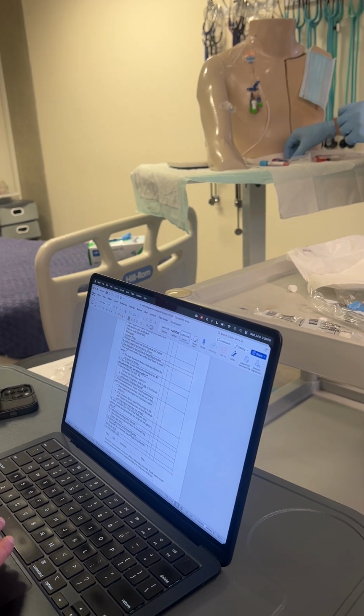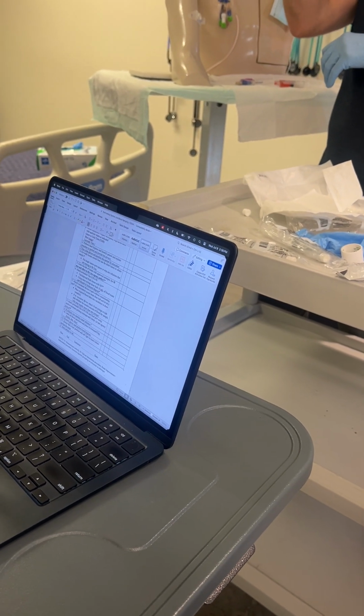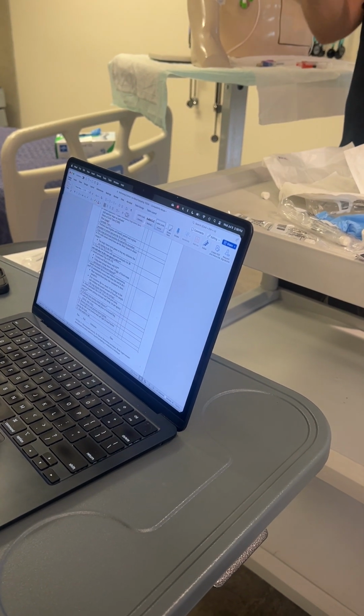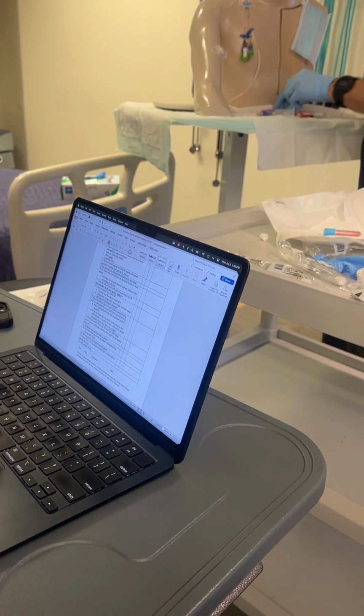So what does that mean? That means you just draw with a syringe because you don't have enough vacuum in there, or get a new tube, it might have lost its vacuum. So if it gets old, it may lose a vacuum. Sometimes people take the tops off and fill it and boom, you just lost your vacuum, right? So just be cognizant that there's different levels of fill here for these.